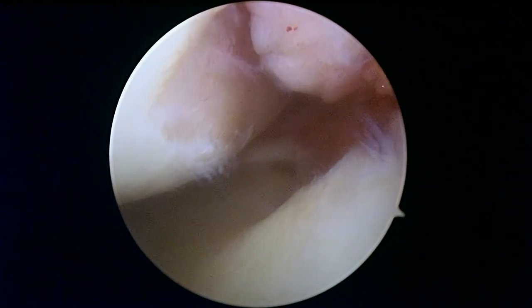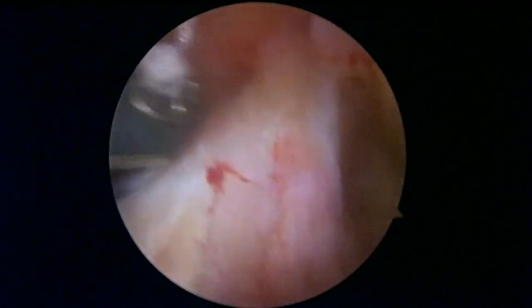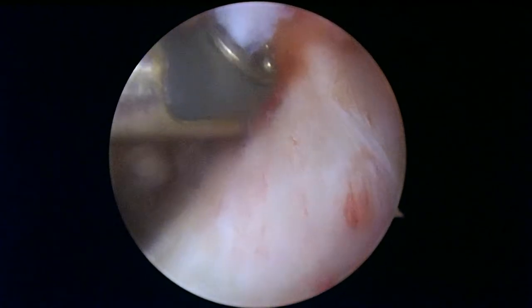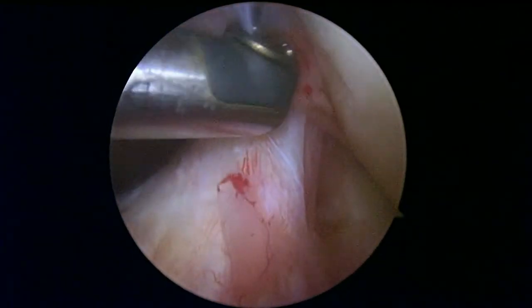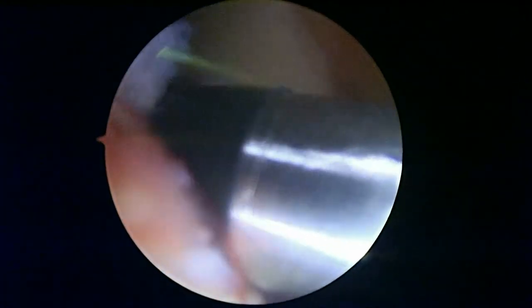Now we're getting a good look at the central part of the knee — this is the area called the notch where the cruciate ligaments are, and that looks pretty good. We're going to make sure there's nothing in the fat pad that's bleeding.